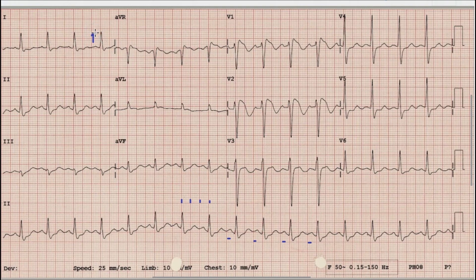For the axis, we look at lead I and lead AVF. The QRS complex is upright in lead I and it is upright in lead AVF as well. So by the rule of thumb, the axis is normal in this case.